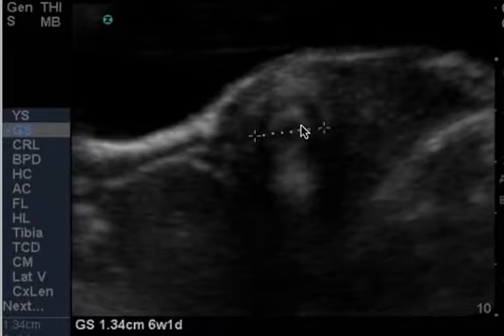Here, you only see a gestational sac that's this big, and so you falsely measured this patient to be farther along than she really is. Again, I think measuring the gestational sac could be falsely reassuring because you could measure a gestational sac that would illustrate a patient to be 6 weeks. But if you don't see an intrauterine pregnancy, then that's concerning and something where I would want at least my providers to be more cautious about and to explore further.